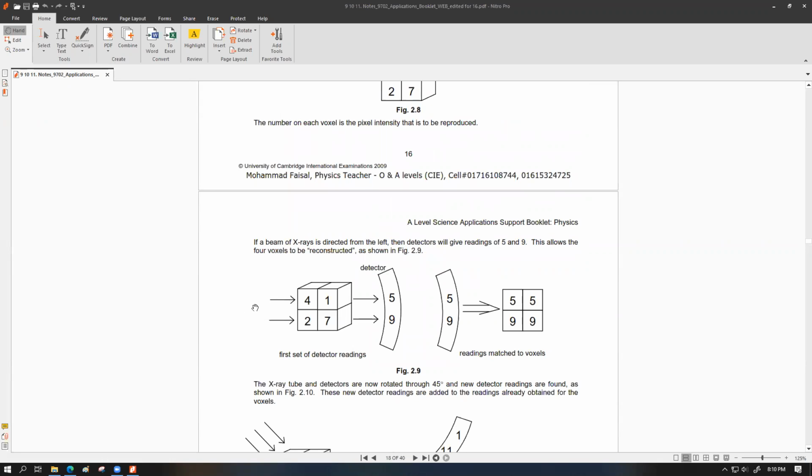First, we are sending a horizontal beam to this amount of human tissue. This is the part that I want you to understand: the CT scanning machine, or the X-ray sensor, has a capability for how many voxels it can sense in a given space.